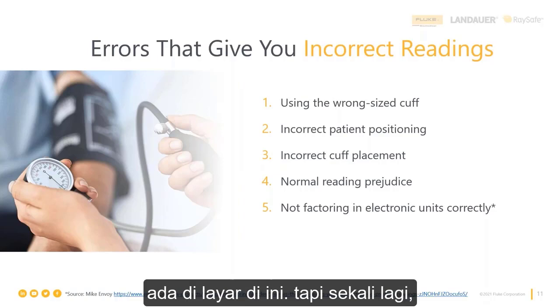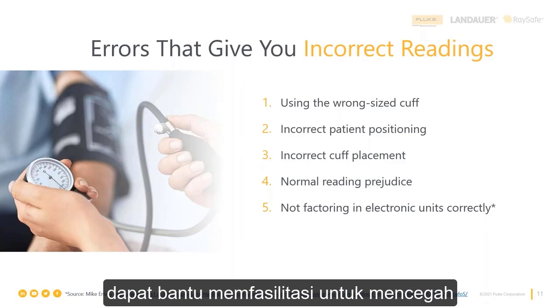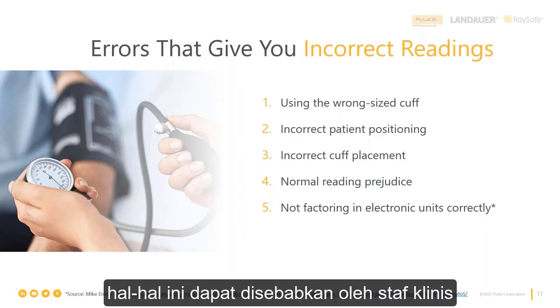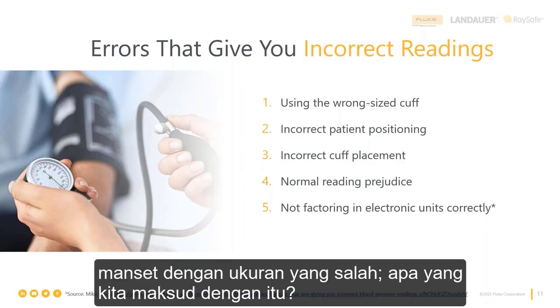So it could be the things that are on the screen here. But again, there's a partnership here that you guys can help facilitate to prevent work for yourselves, because a lot of these can be caused by the clinical staff themselves. Yeah, so here's a couple of tips. Wrong size cuff. Well, what do we mean by that?